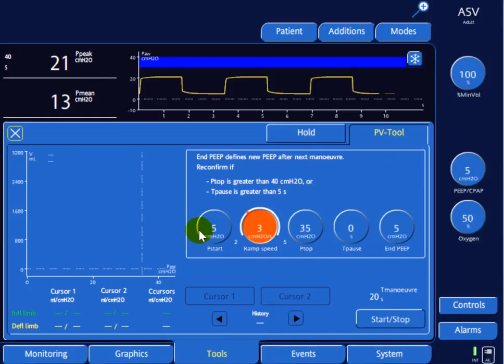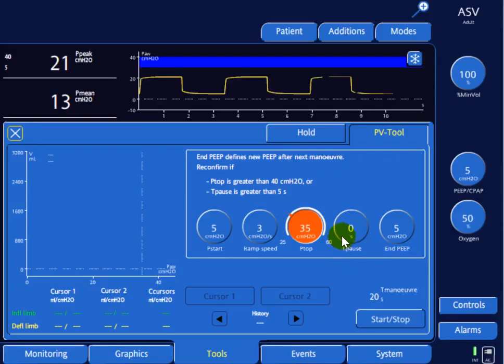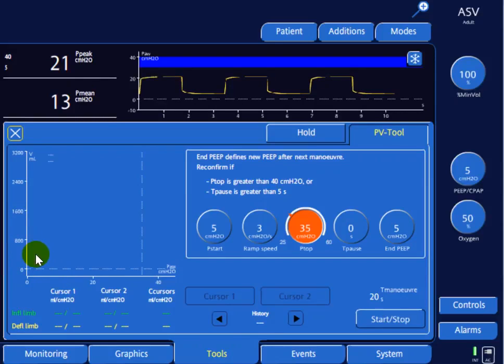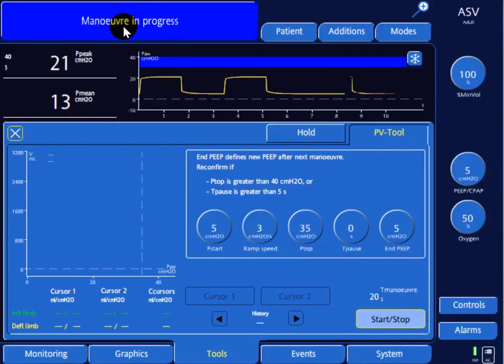That means it will take 10 seconds to go from 5 to 35. Once we reach that pressure, we'll come back down at the same rate of 3 centimeters of water per second with no pause. Once we click Start, the pressure will rise from 5 to 35 and then return to 5. On the left graph we'll see the pressure-volume curve — pressure on the x-axis and volume on the y-axis. Let's start the maneuver.